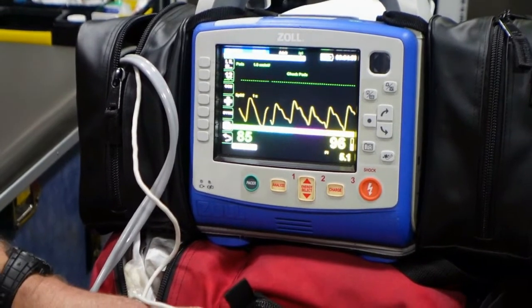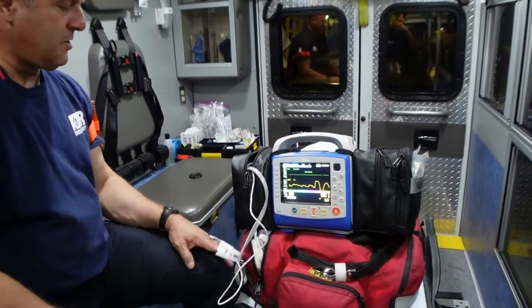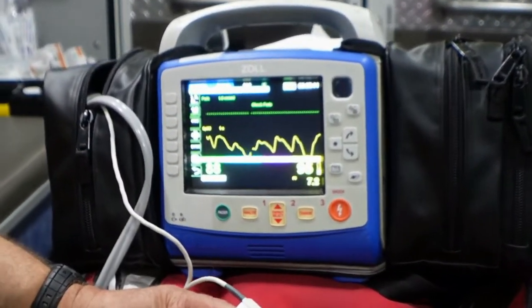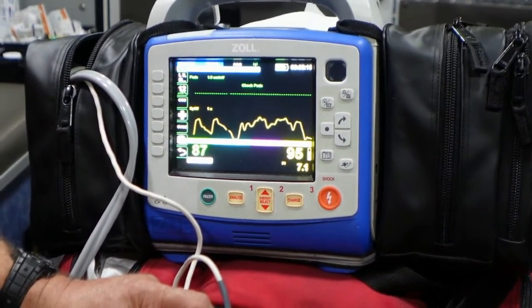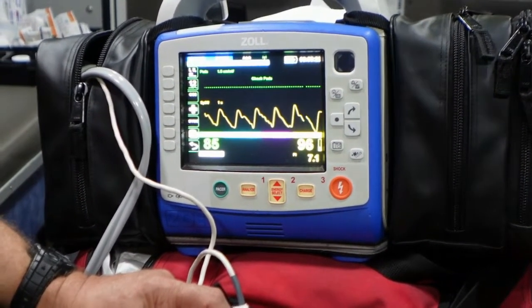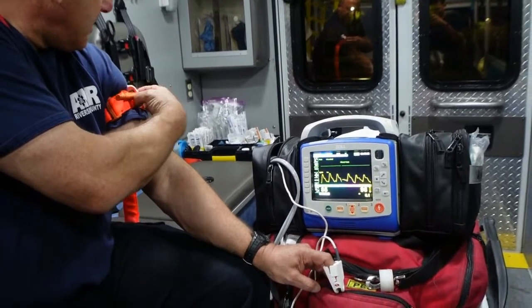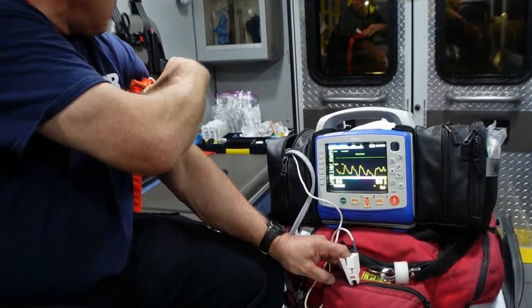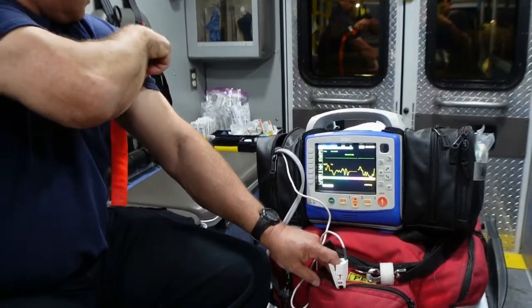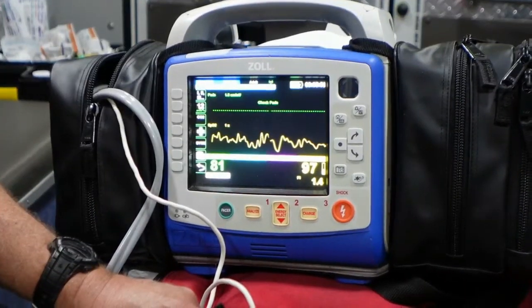If I want to check distal circulation, I have to establish my Pulse Ox capture — it will only work if there is distal circulation. We can experiment with occlusion two different ways. I've got a tourniquet applied, and I'm going to go ahead and apply this until I lose arterial circulation to the fingers. Look what happens — my capture goes away. This is a garbage capture.